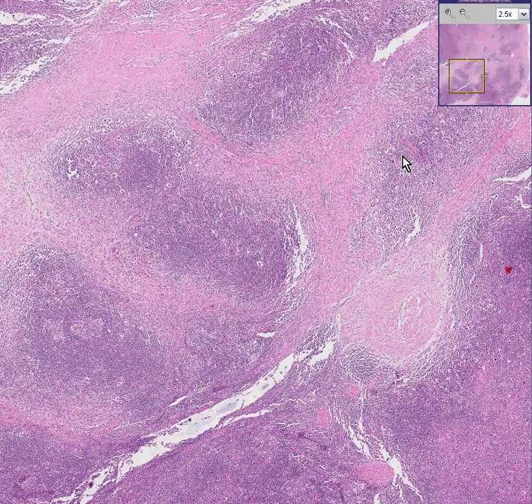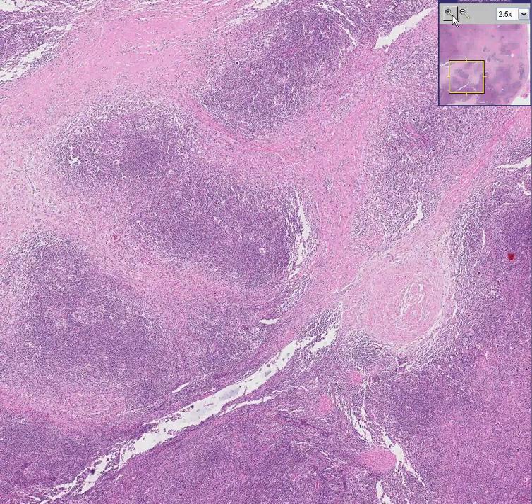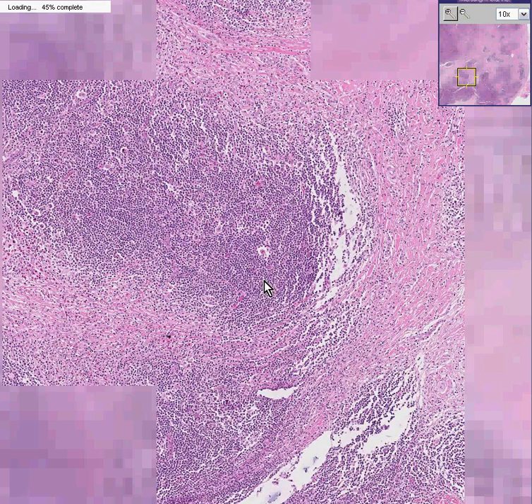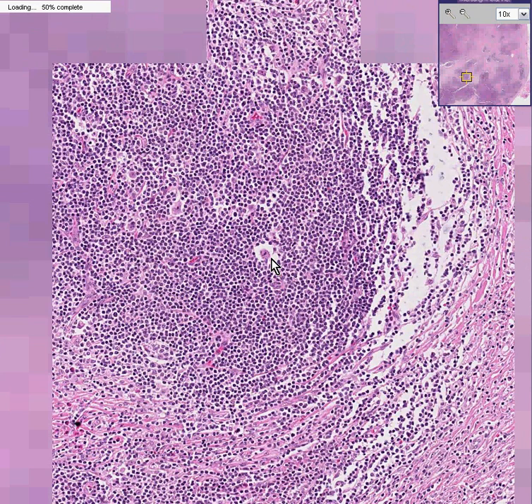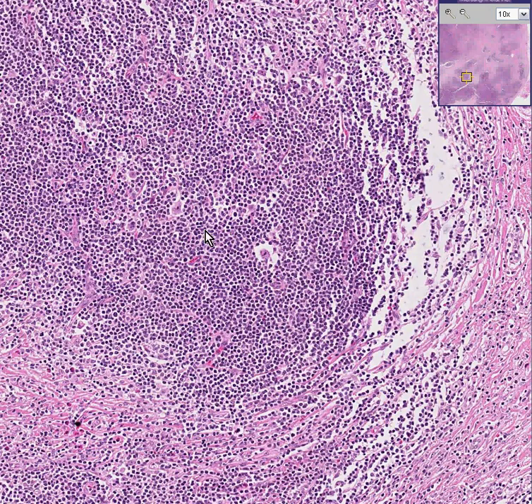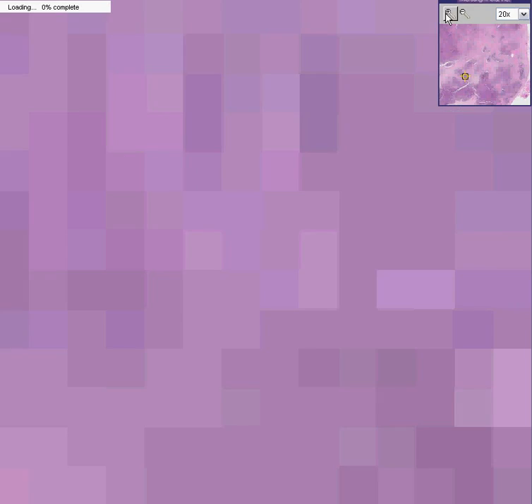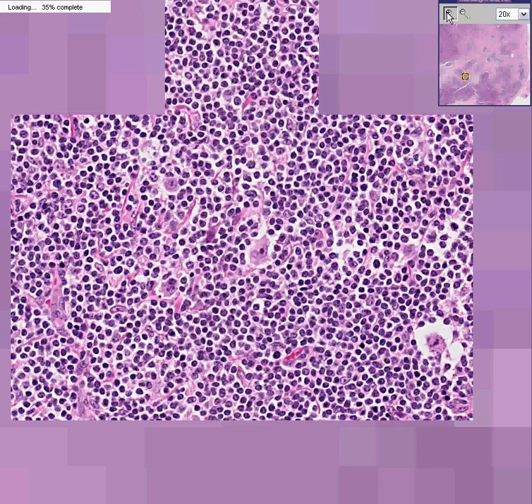Notice that in these bands of fibrous tissue, dense fibrous tissue between nodules, in some areas you see large cells like here, and here, and here, and maybe a little bit out here, probably here, definitely here. They almost look like they are cells that are within their own little lacunae, and they're large cells, and they are irregular cells. And these are what they call lacunar cells. And here's one, here's probably one. These are all variants of Reed-Sternberg cells. Some of the pure people don't want to call them Reed-Sternberg cells. They'd rather call them lacunar cells, but they are Reed-Sternberg cells.